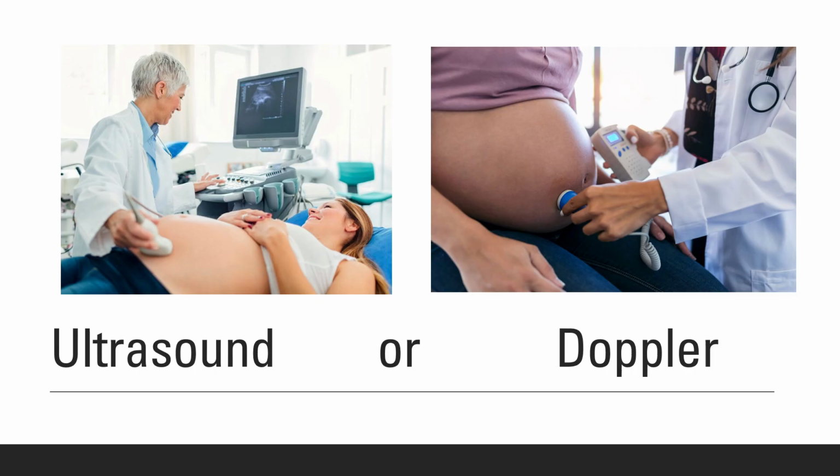And obviously you have your Doppler, very similar to the Dopplers that we use for DVTs and so forth, and blood flow. Very similar, but this one is to capture the fetal heart tone.